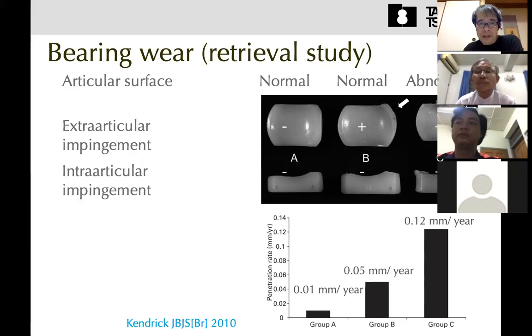It can dislocate due to having no constraints. The bearing can move completely passively, according to the movement of the tibial and femoral components.